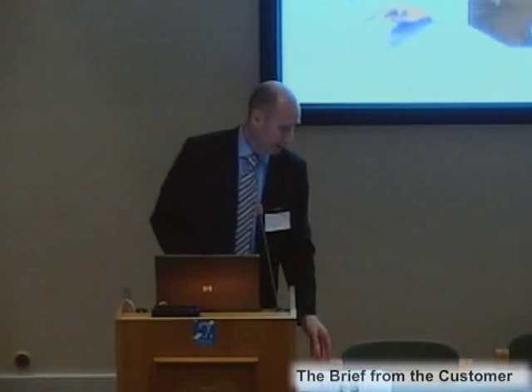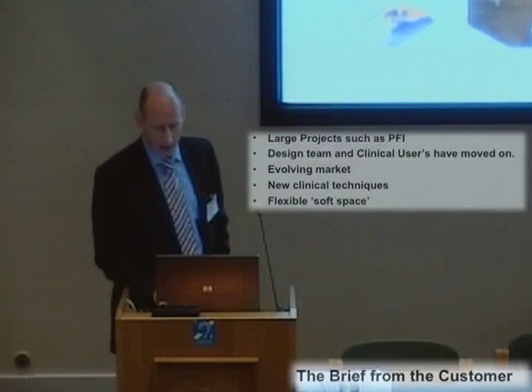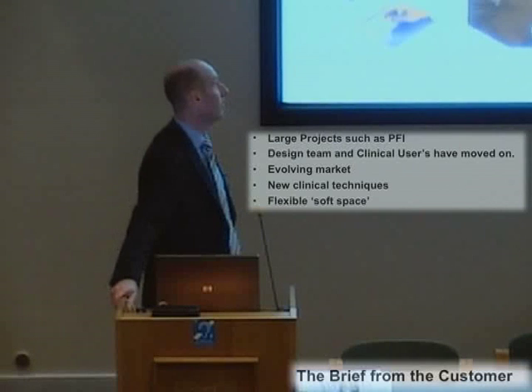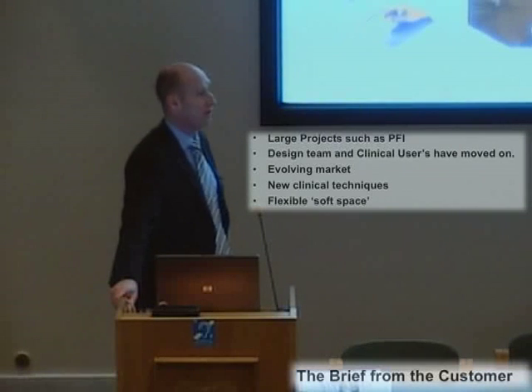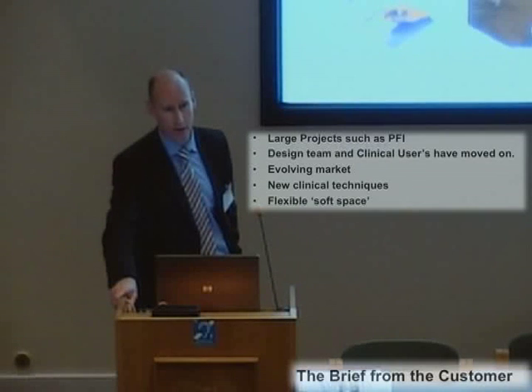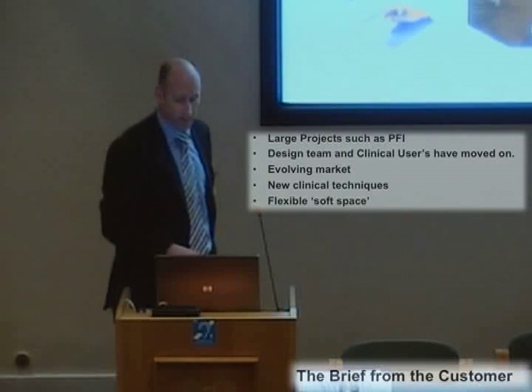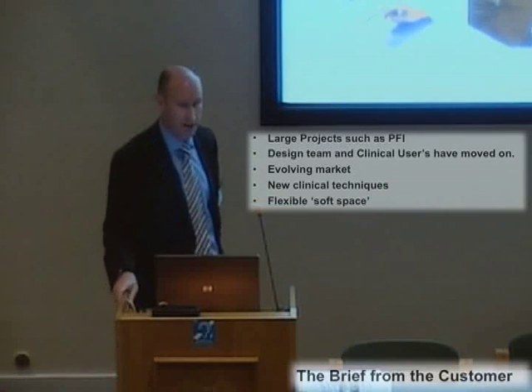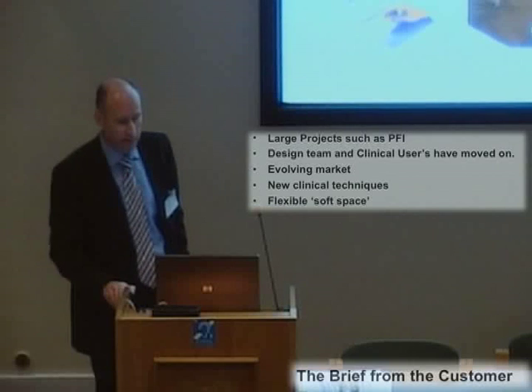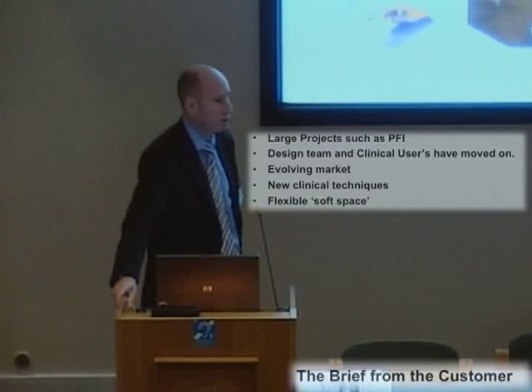Now, that all sounds very easy, but there are obviously complications to larger projects, in particular the PFIs. So the brief from the customer at the PFI maybe 6 or 7 years ago may be very different to what it is today. So if we started off in a PFI, say in 2005, you may find that the design team originally in 2005 and the clinical users, they've moved on. They're no longer with that hospital trust anymore.